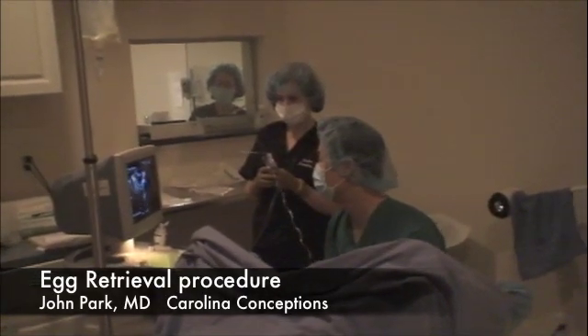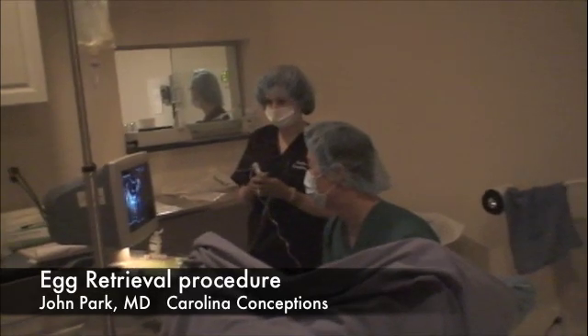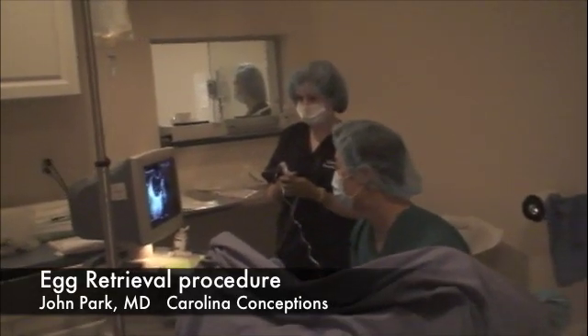Hi, this is Dr. Park from Carolina Conceptions, and this is a video demonstrating the egg retrieval procedure that's part of the IVF process.